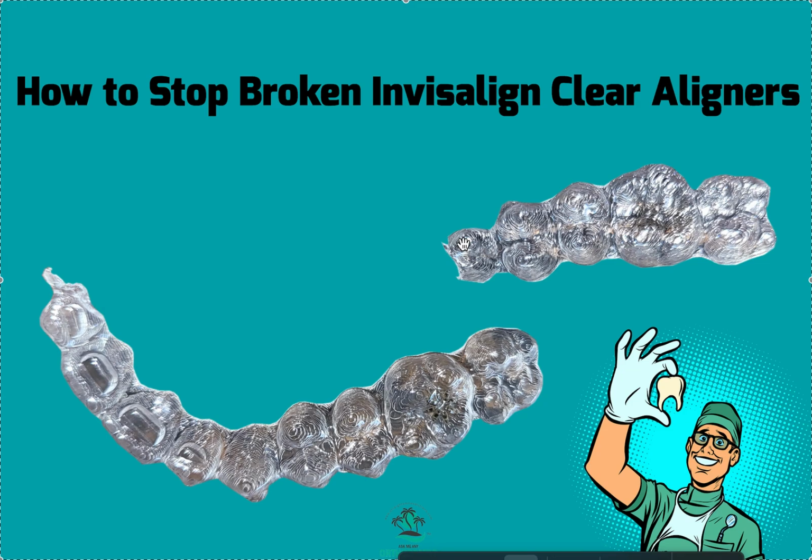If they didn't save their old aligners, it's probably going to take at least a week and a half for the new replacement aligners to come in, which is too long to be without them. So hopefully they save their old ones. Otherwise, they can go to the next one, which maybe doesn't fit super well, but it's something at least. Otherwise, even better if you can make an in-house retainer temporarily. A lot of labs will turn them around same day if they're local labs.